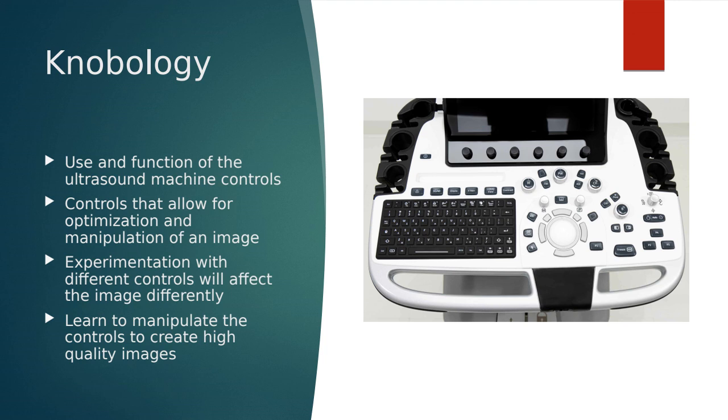We have to be comfortable with trying new things and experimenting, really seeing how manipulating a specific control has an effect on your picture. We're going to be learning how to manipulate the controls that we have here at the school. Keep in the back of your mind that when you start clinical and work at different facilities, the machines are a little different from what we have at the school. For the most part, you're going to have the same applications on the machines. They just may be located in different areas, and you may have to adjust them differently.